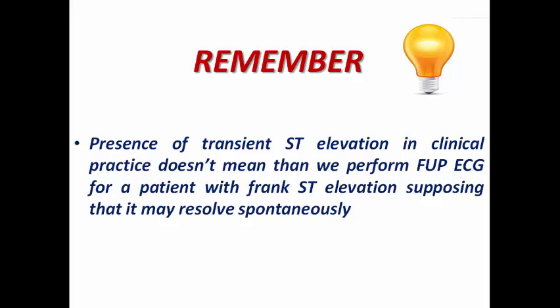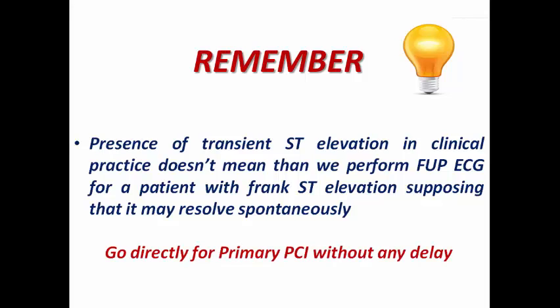But in some cases when the patient is referred to another hospital and he became chest pain free, we may decide to repeat the ECG and the ST elevation resolves. So follow-up ECG sometimes is performed in case of transfer, and it may show evidence of complete resolution of ST elevation, suggesting that this was transient ST elevation. And so go directly for primary PCI without any delay if you just detect ST elevation in one ECG without follow-up ECG.